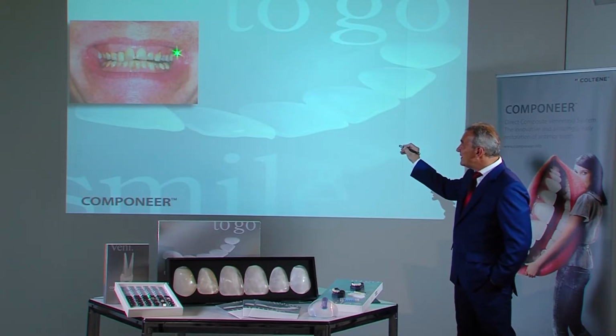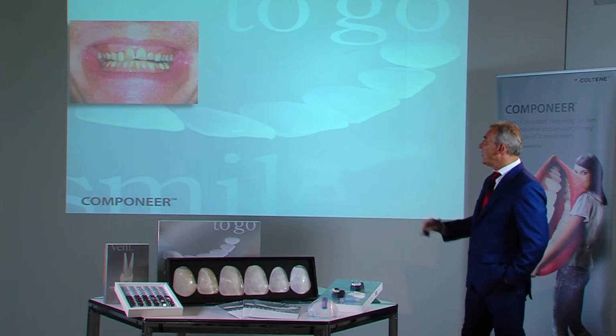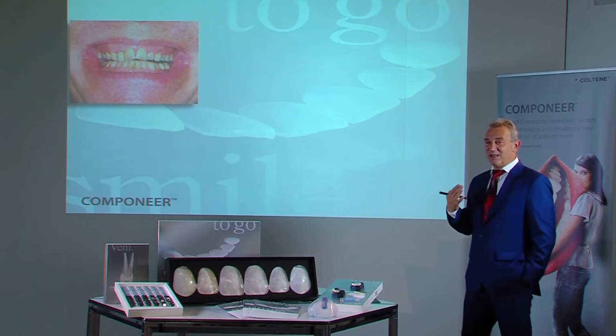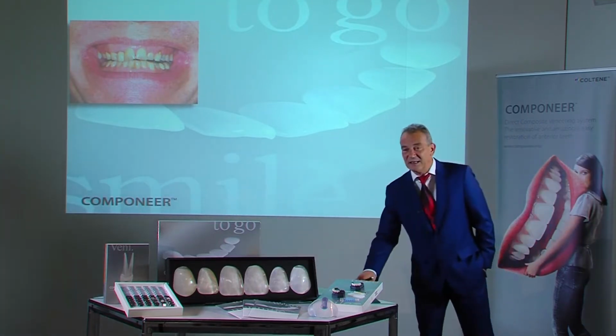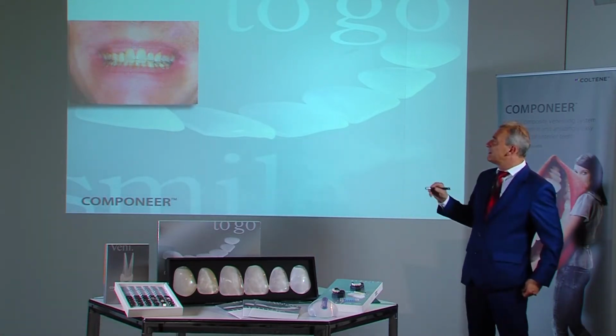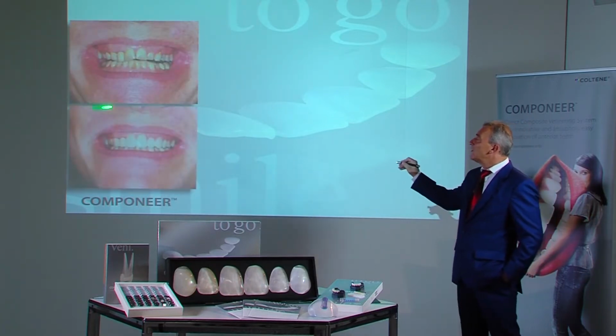One imagines what the lips look like. Look at the contours of the lower and upper lip. How are the lower teeth? And then one sees that we're dealing with an inverted occlusion level. We therefore need to imagine that the teeth would be somewhat longer in the correct position. One creates an image, slowly projects the situation, and then prepares it temporarily with composite.